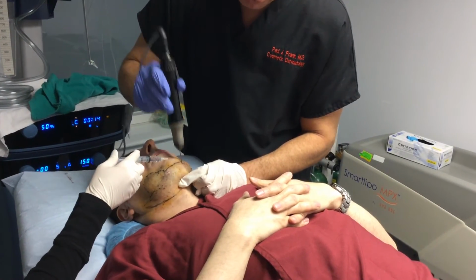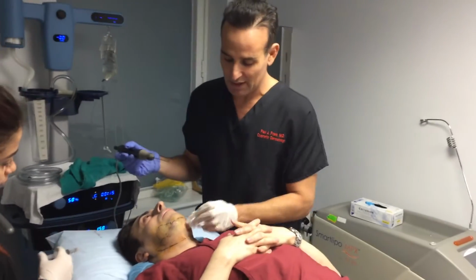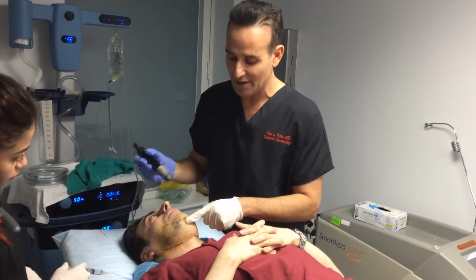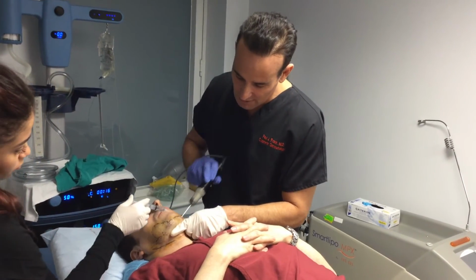And this is a bloodless procedure. So this is basically it. I'm going to be doing this for about 15-20 minutes. I'll be able to massage out any fat and do some random work to sculpt out the tissue.